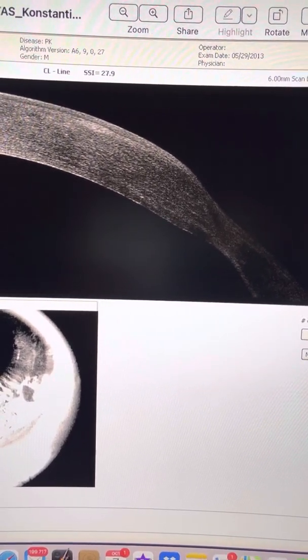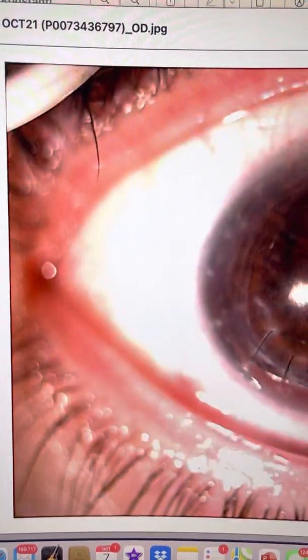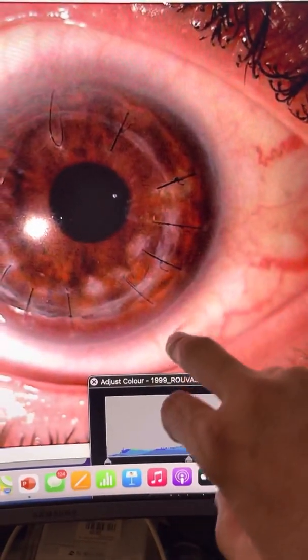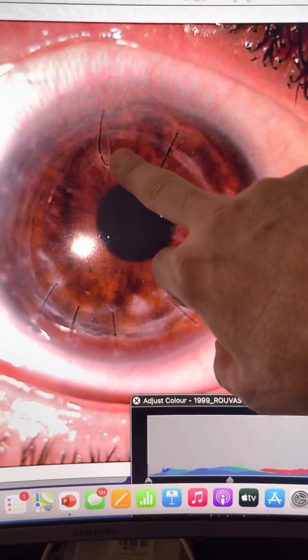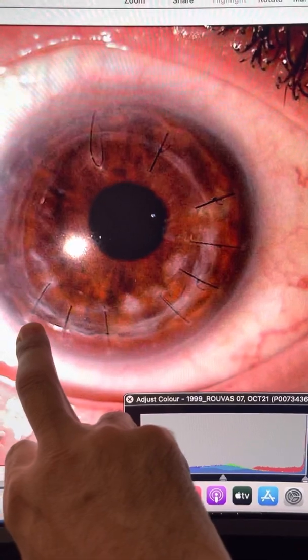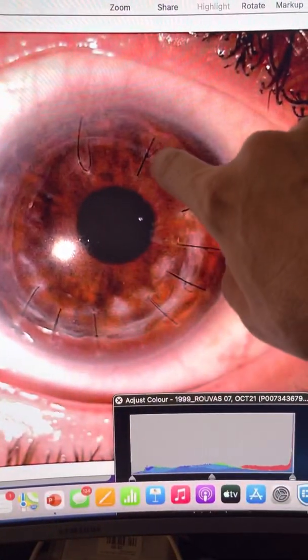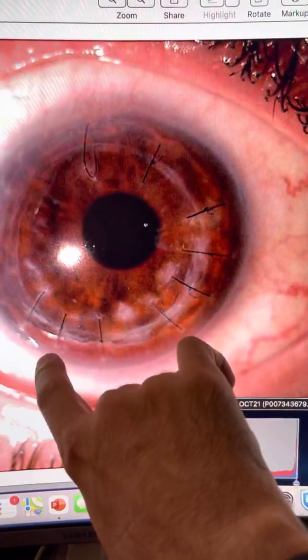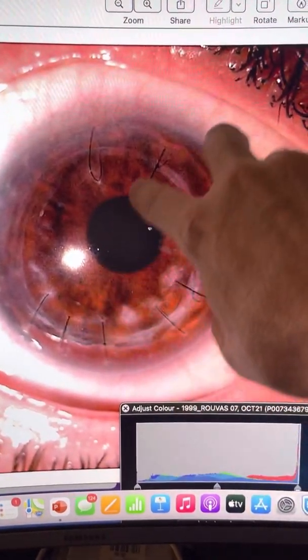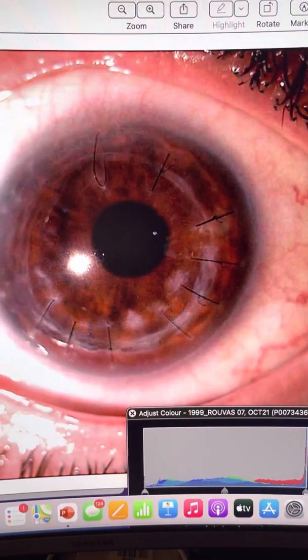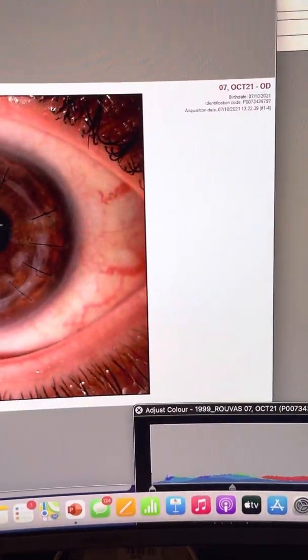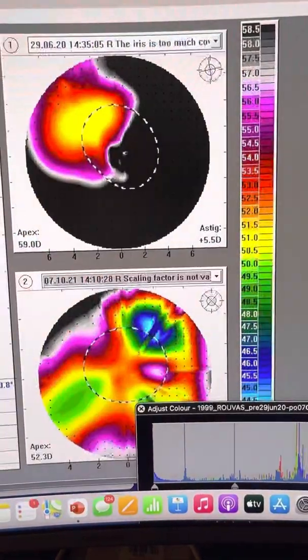So this is the cornea today. We're a year and so later. You can see that this gape does not exist anymore. Today, we took out 12 o'clock and 7:30 to 8 o'clock sutures that were loose. And then the 1 o'clock and the 7 o'clock here, because we had topographically five diopters of astigmatism, and he jumped to almost nil astigmatism into an astounding with one diopter of myopia, 20/20.